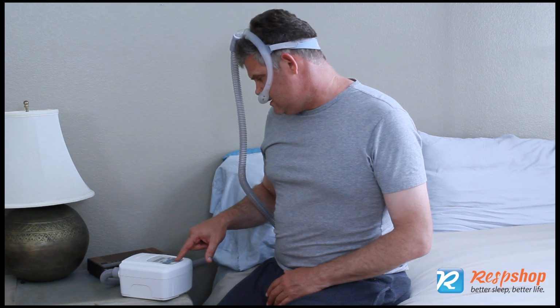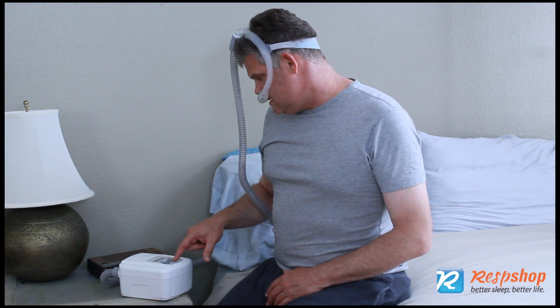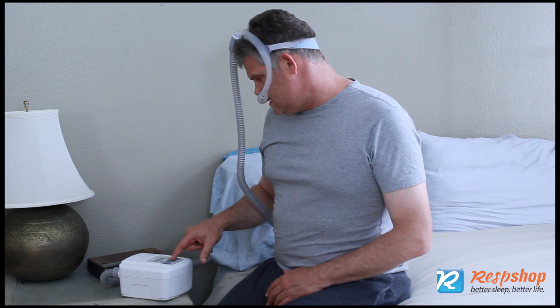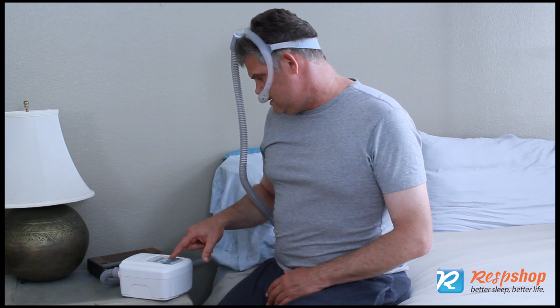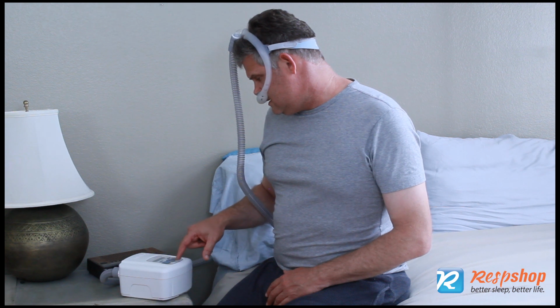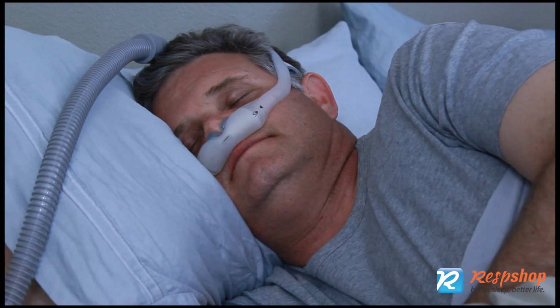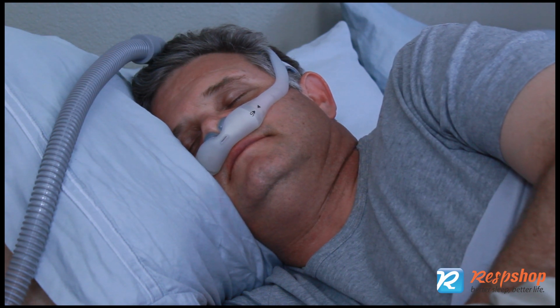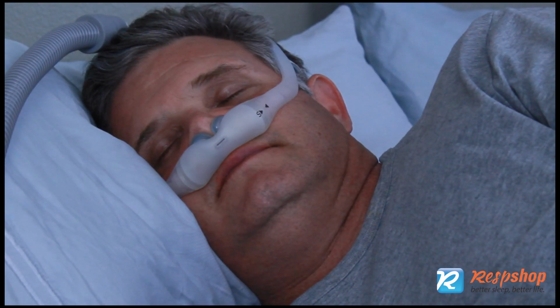CPAP machines can compensate for some leak, but if the machine keeps alarming, it's too much. If the air is blowing into your eyes, it's definitely too much. The CPAP machine compensates for leaks with extra flow. If that added flow makes it hard to breathe, or the system gets too loud, then it's too much. But if you are comfortable and the machine is not alarming, everything can just stay as it is. No adjustments needed. That's the magic of leak compensation.